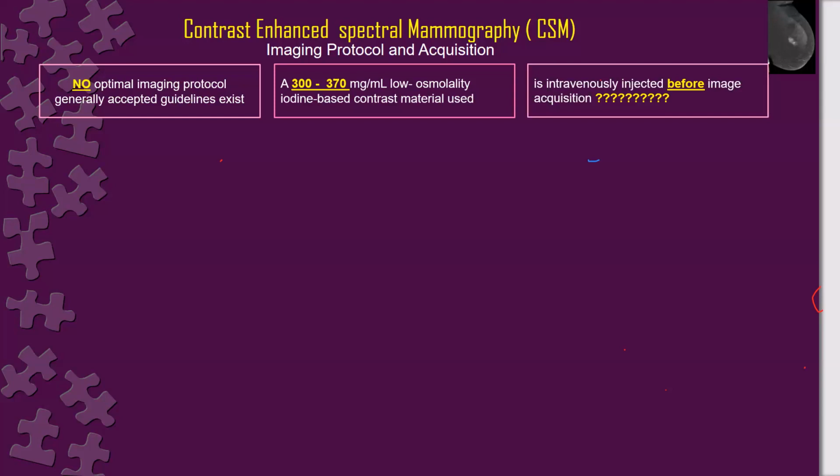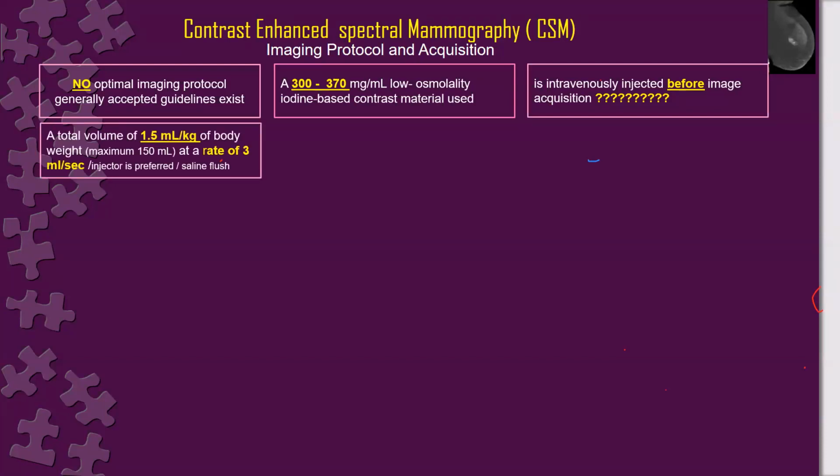Why do they inject contrast before image acquisition? There is a gap of about 2 minutes before taking the images for enhancement.